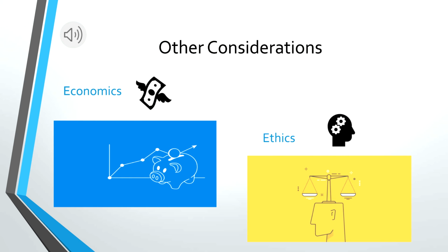There is a fairly large ethical concern associated with the ECMO device. When should someone be taken off of life support? This artificial heart and lung can be a life-saving machine, but it can also be a path to nowhere. Since these machines are usually used as a last resort, there's a chance of failure and subsequently death. This raises the question, how long do we keep patients on this device without any signs of recovery? These devices are incredibly expensive to operate and keep the patient hospitalized, so physicians cannot keep someone supported forever.